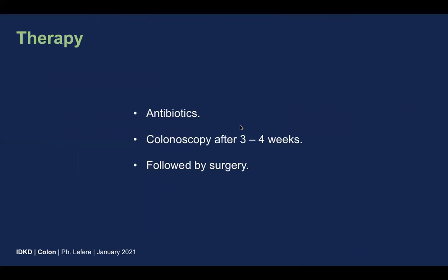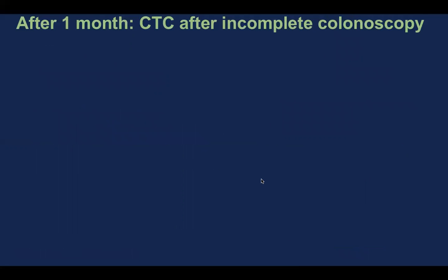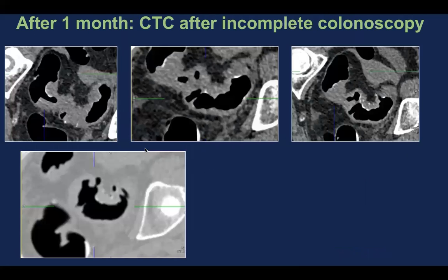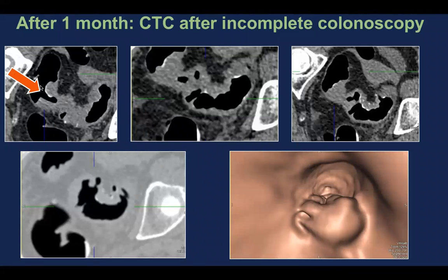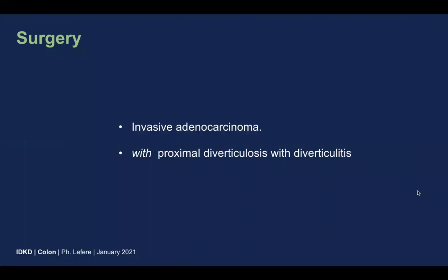In this patient, antibiotics were given for three to four weeks. Colonoscopy was performed after three to four weeks, followed by surgery. However, colonoscopy was incomplete and CT colonography needed to be performed. On the 2D images, we see that in the proximal zone the wall thickening has become less prominent due to antibiotics, with diverticula visible, and we clearly see the shouldering in the distal zone. In 3D, there is distortion of the folds and a clear tumor with overhanging edges and shoulder formation. Surgery showed invasive adenocarcinoma in the distal zone, with diverticulosis and diverticulitis in the proximal zone.